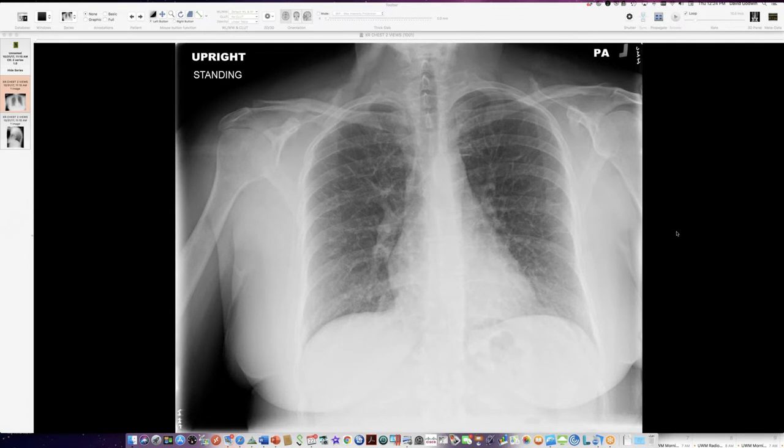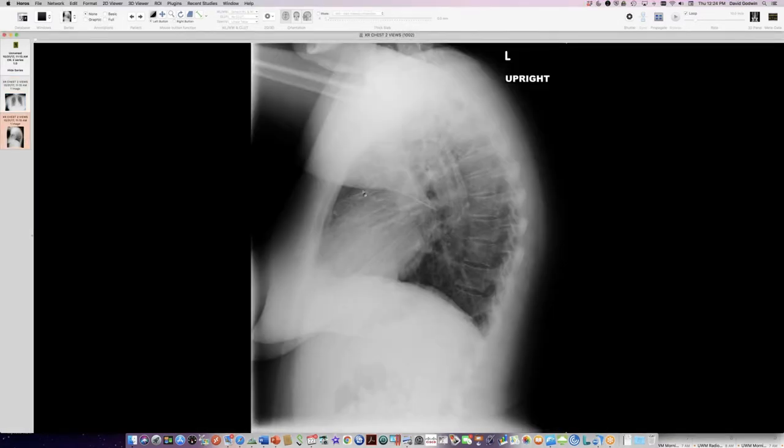So I hope people can see a chest radiograph with a few peripheral fat-looking septal lines, mostly in the upper lungs on both sides. So it's not normal, but kind of nondescript. Usually edema is worse in the bases in somebody who's been standing up. You can see that there's some thickening of the fissures, which goes along with that edema look.